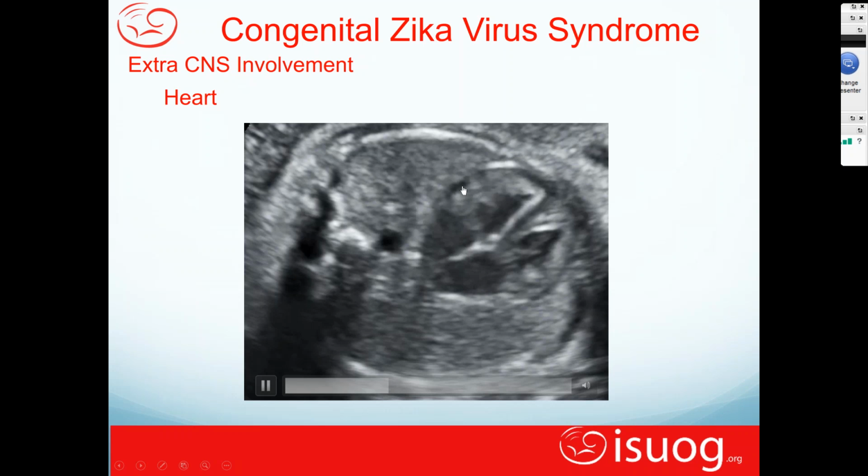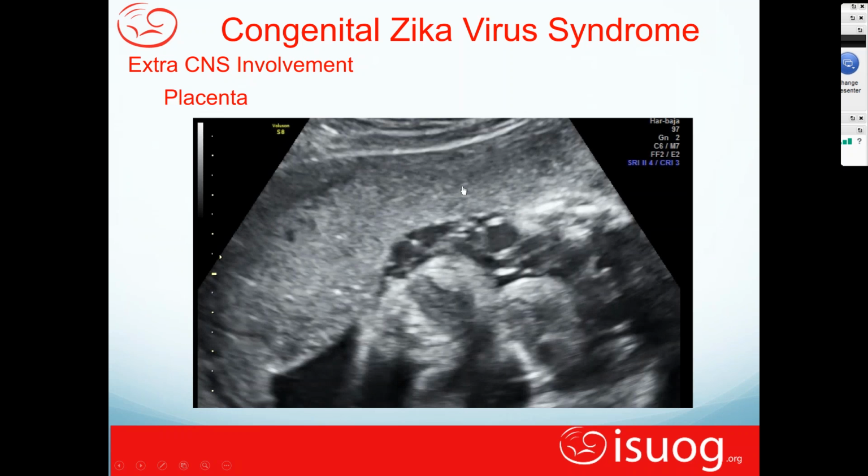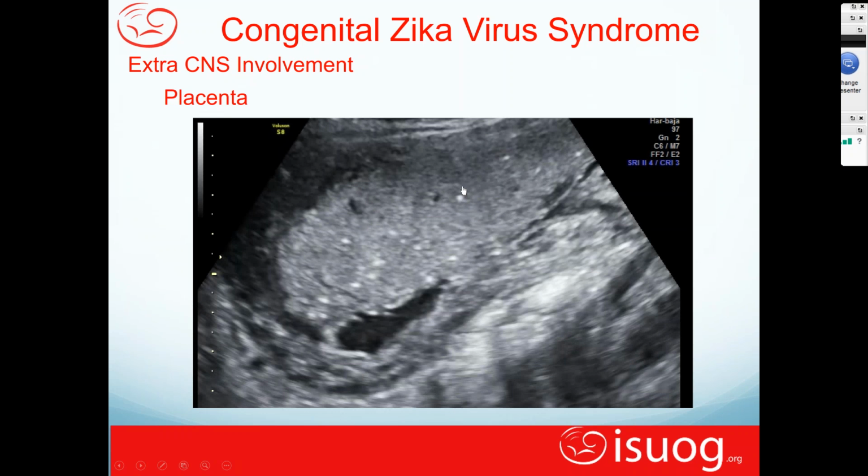Placental changes as well. You see calcification within the placenta. Again, you and I know that there are many reasons for calcifications within the placenta, that may not be everything that you need to recognize and to do along those ways.